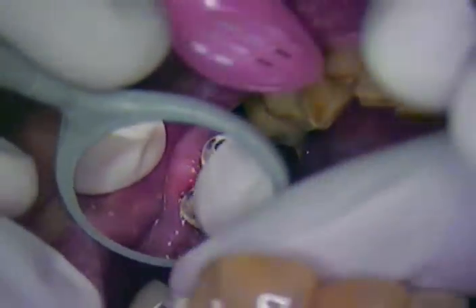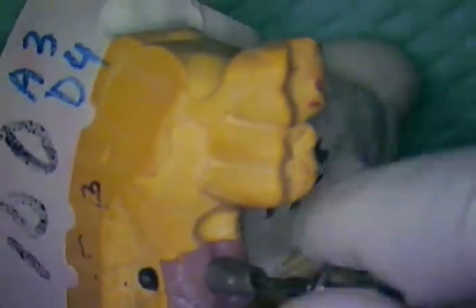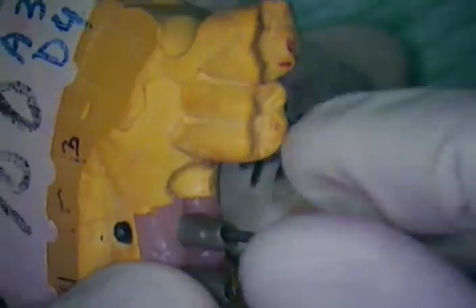Before I take these out, they're nice and loose. Before I get rid of those, I want to go over to the model and have my abutments ready to go in. These are highly polished subgingivally and we sandblasted the surface on which the cement is going to be received.